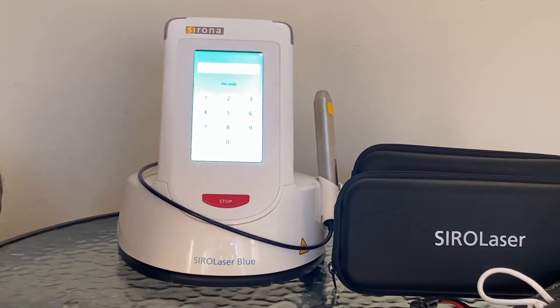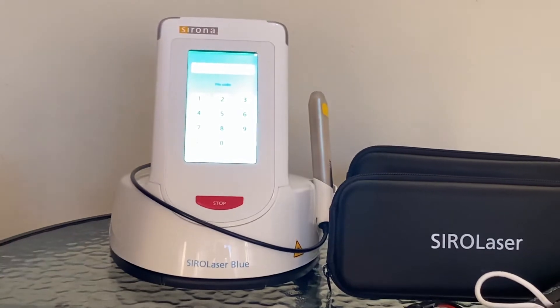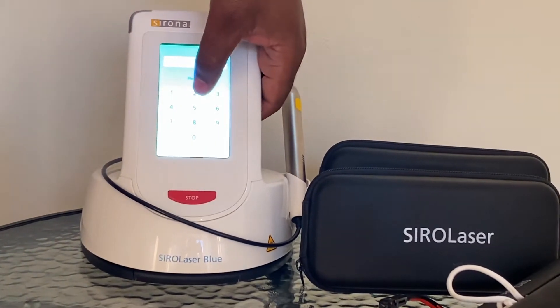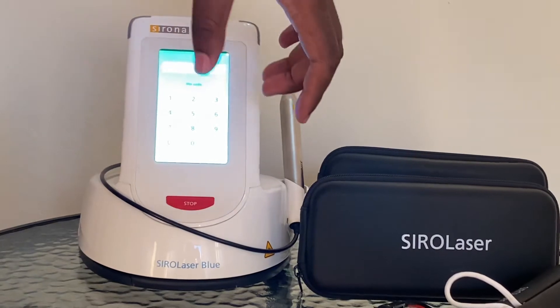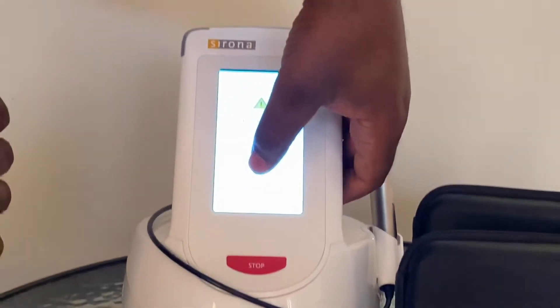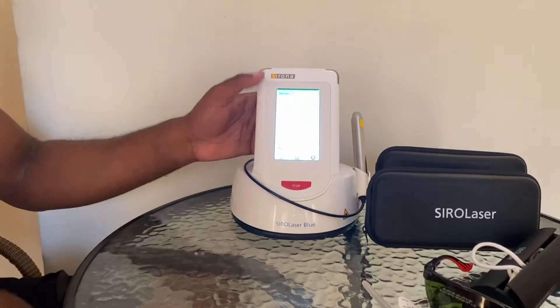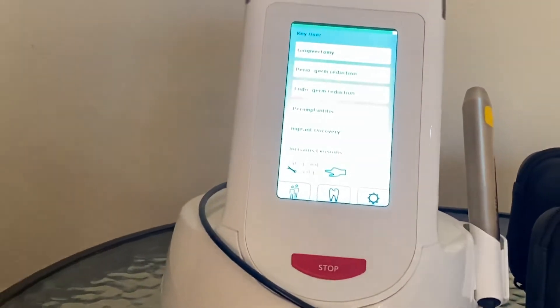The machine is still insisting you need to read everything that's written. When you work in a clinic where there are many potential users of the machine, personally I like to save my programs and therefore I have a password for my laser machine. So let's key in the PIN. There you go — since I use this a lot, these are my preferred programs.